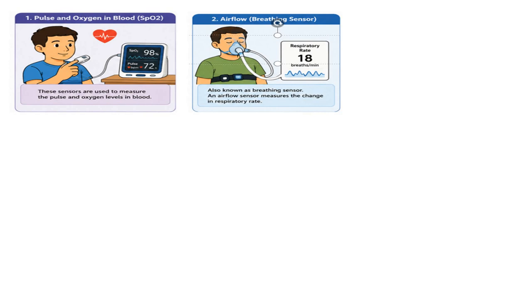In a healthcare IoT system, airflow sensors transmit respiratory data to healthcare professionals for remote monitoring and timely medical intervention when abnormal breathing patterns are detected.